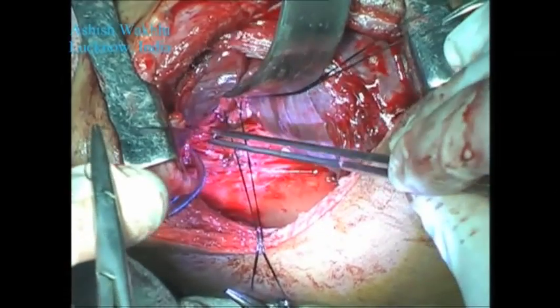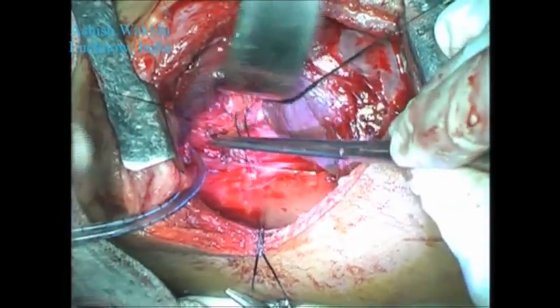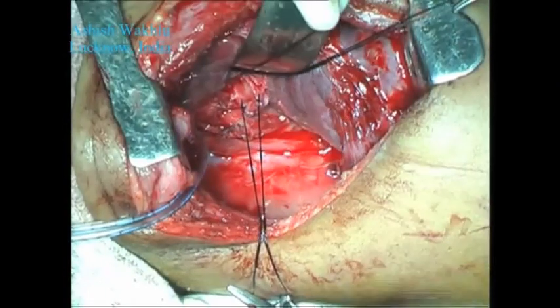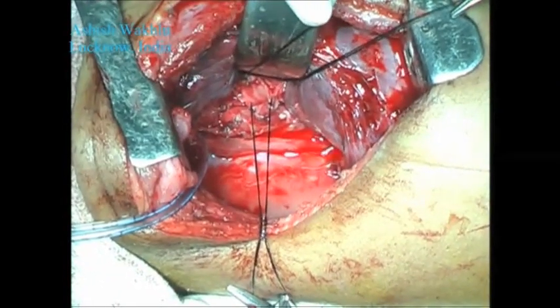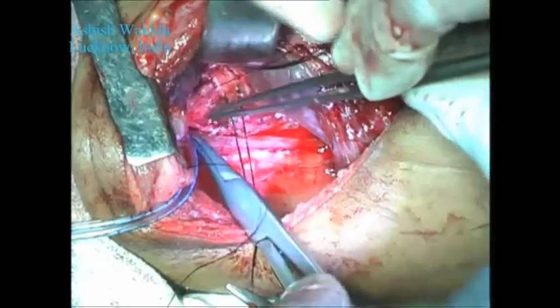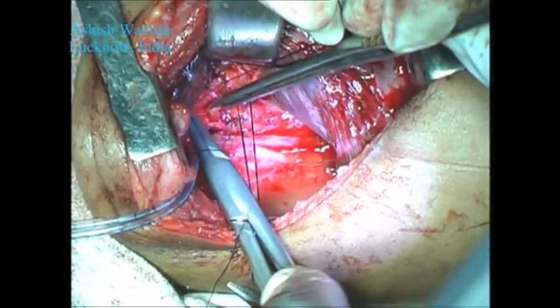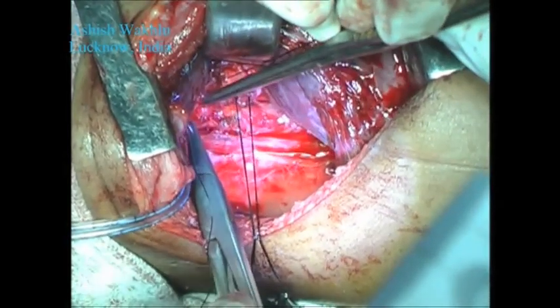Eventually, we have cleared up a sufficient length of the stump of the right main bronchus to be able to perform the anastomosis with the hilum of the lung, and we'll now apply a stay suture on the other side of the stump and open it between the stay sutures to effect the anastomosis.